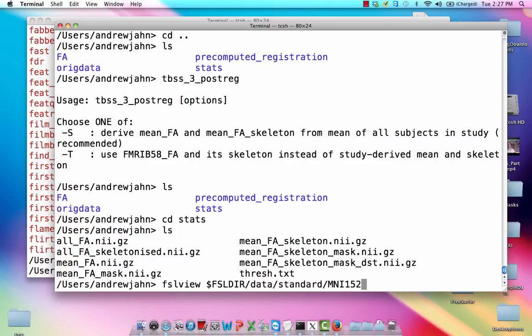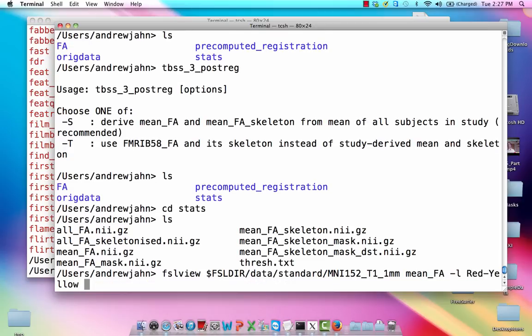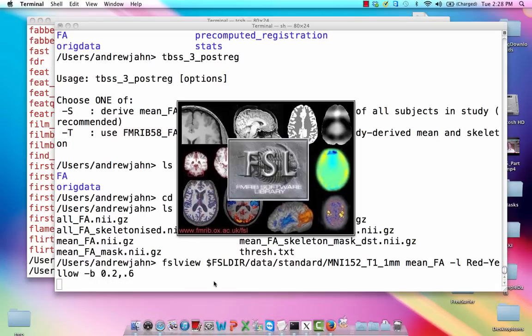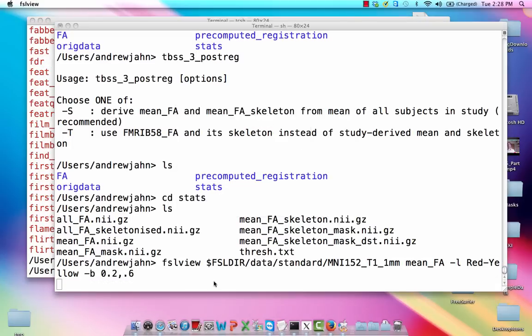So I'm going to use the MNI 152 T1. That's a good template. That's a space that was registered to, so we should be able to see it there. And I'm going to use the color scheme of red minus yellow, which is just like a heat map. And the boundaries of the intensity is 0.2 to 0.6 is pretty good.